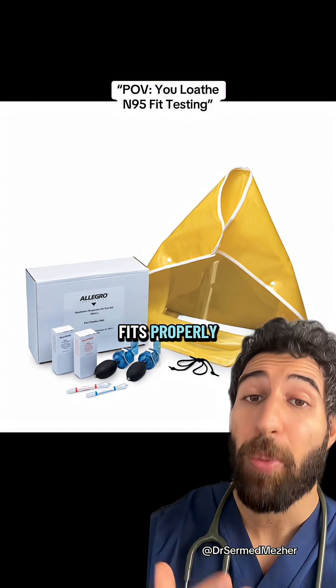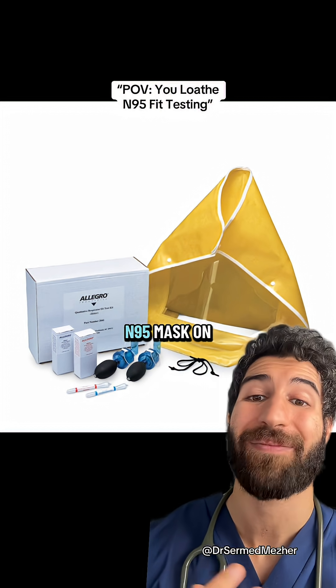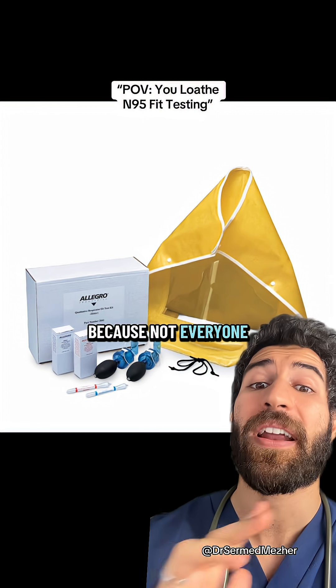To check if it actually fits properly, people are sprayed with a bitter solution once they have the mask on. But the sharp ones of you will realize she didn't have the N95 mask on, and the reason why is they have to test if somebody can actually detect that bitter taste first, because not everyone can.